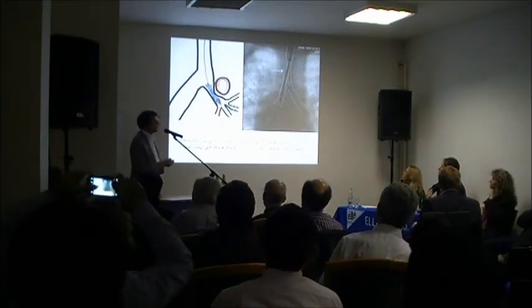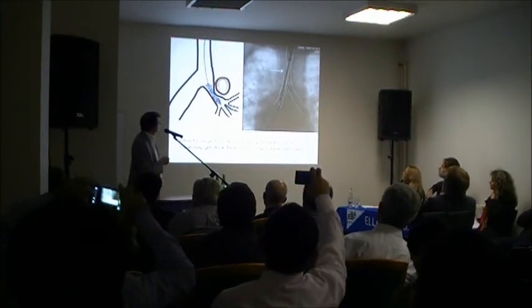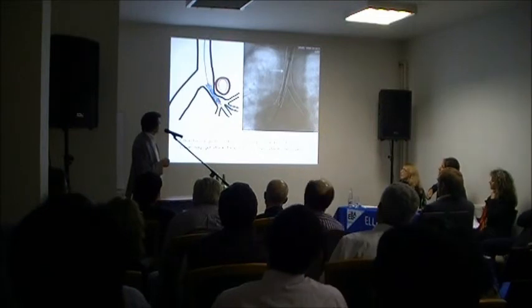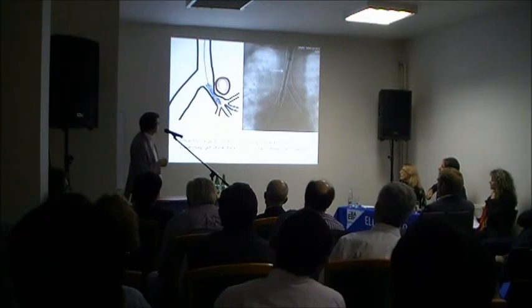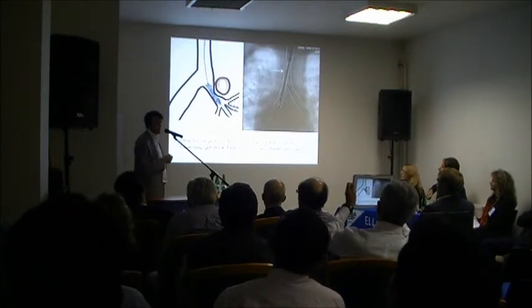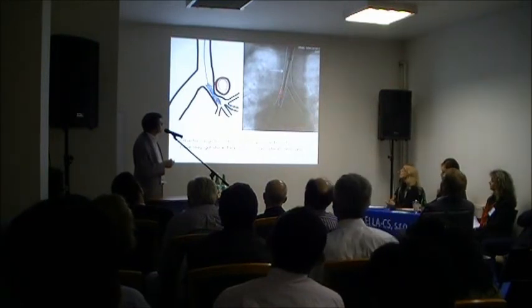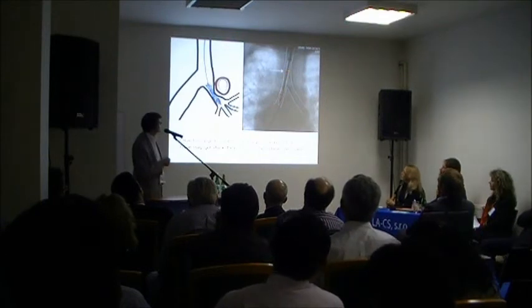Technically, just a few problems that we've experienced. It's this issue here. We have the stent, we have the olive, and the problem is, number one, that the olive is quite large, so if we have compression, it's quite difficult to pull the olive up here through the deployed stent if the stenosis is tightened. Sometimes these are vascular compression, so we have no option but to do that, and you'll see here we have, by mistake, pulled the whole stent up. There's the stent moving out of the bronchus because of this.